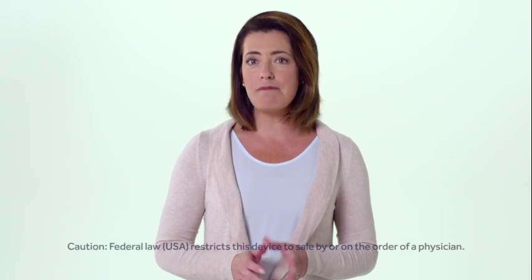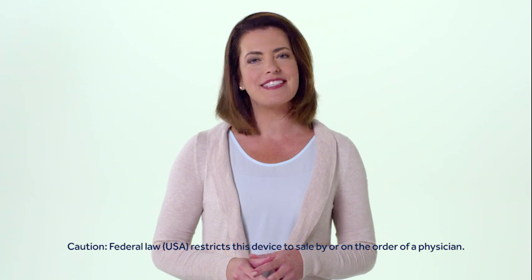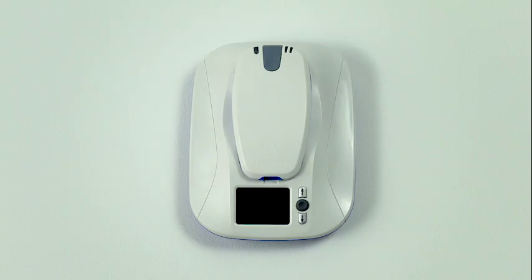In the next several minutes, I'll show you how to set up your new MyCareLink patient monitor and send your first transmission. So, let's get started. The MyCareLink monitor comes ready to use. Just take it out of the box and place it close to a power outlet near where you sleep.